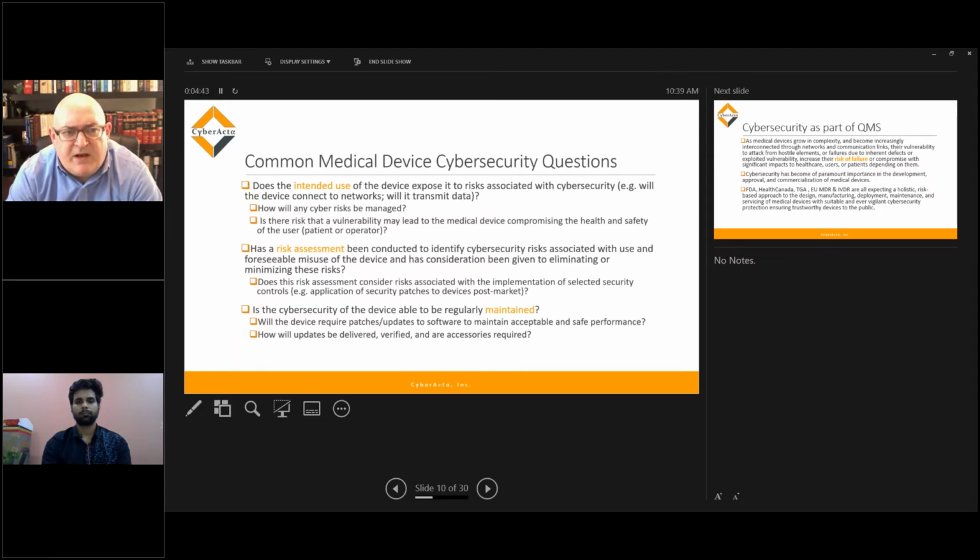The second question is really about the cyber risk management or cyber risk assessment: how do you consider those risks as part of a foreseeable misuse of that particular device? And have you taken any steps in considering or eliminating those risks? So really what they're asking for is the activities that have been taken from a design standpoint, what's called security by design, and as soon as the product goes to the market, how does the manufacturer demonstrate surveillance of those risks and how they're communicated to the users or customers?